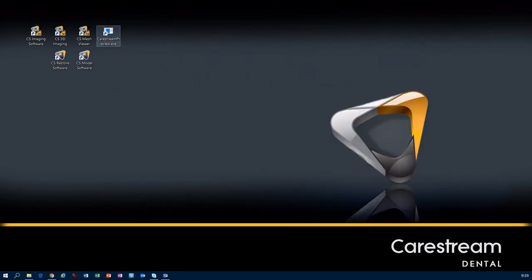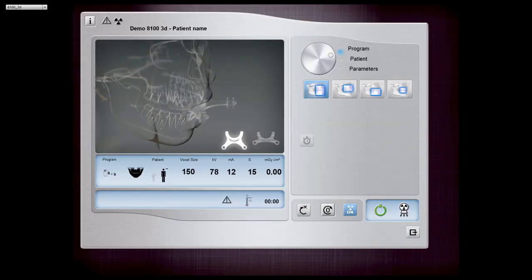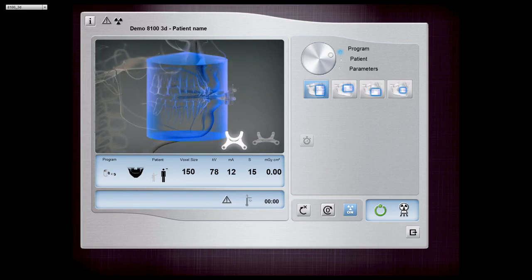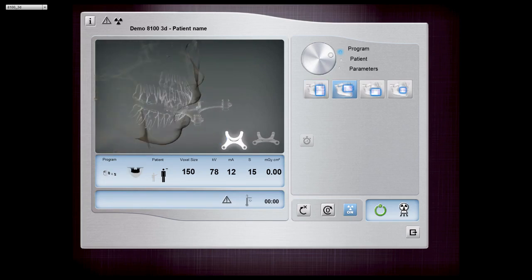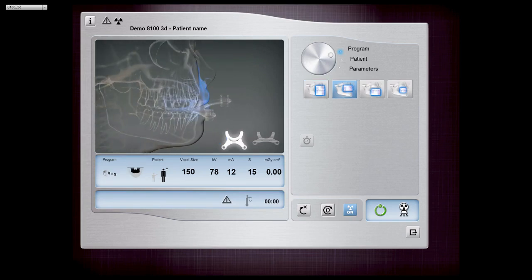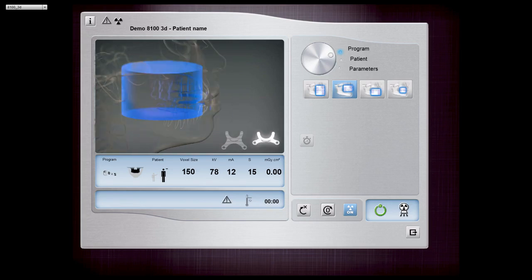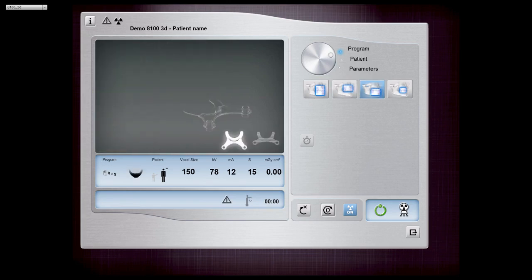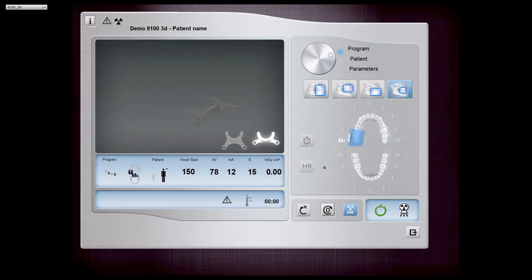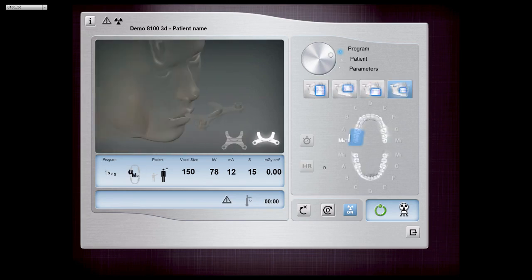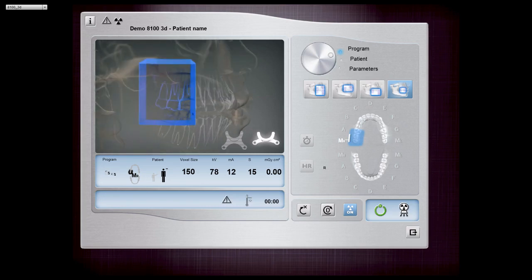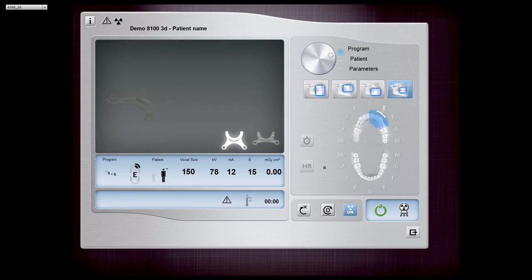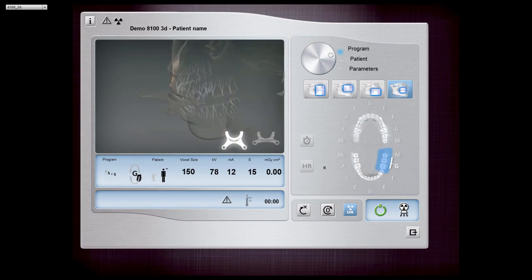Click on this new icon, then we have the selection of, for example, how to demonstrate an 8100 3D. Here we have the acquisition and we can simulate big volumes 8x9, small volumes 8x5, or small volumes 5x5, depending if we are in one part, upper or lower jaw.